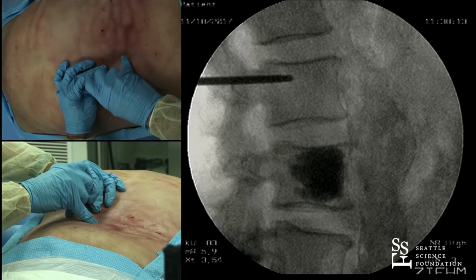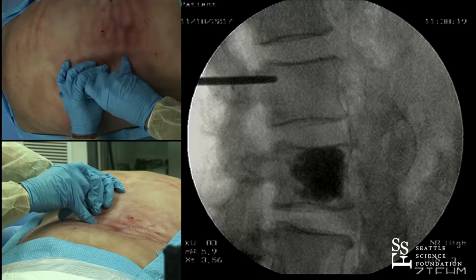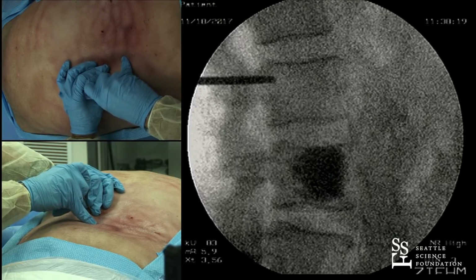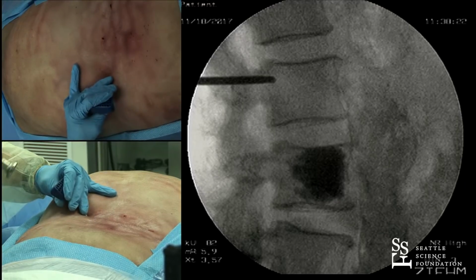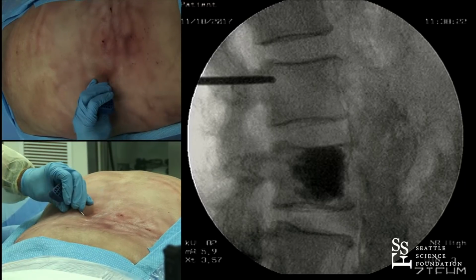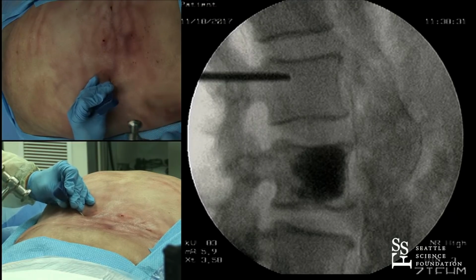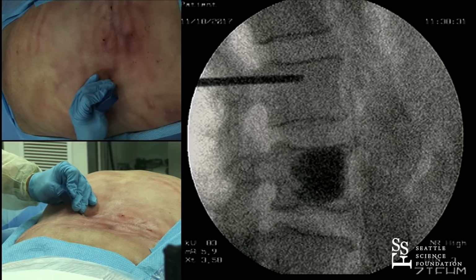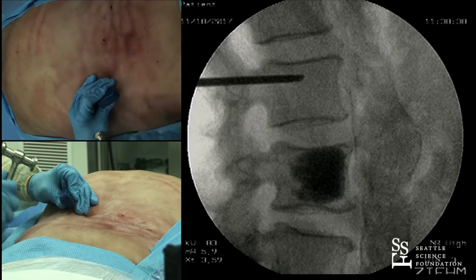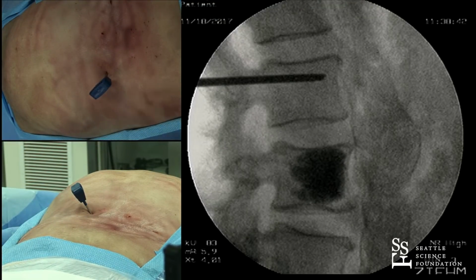He's backing up toward the base of the pedicle. He's now back to the posterior wall. Turn the bevel so that it skives you to the center. And I'm going to put this needle tip more medial. Angle it more medially, and you'll end up in the center of the vertebral body. What I'm going to do, instead of going out with the K-wire, I'm going out with the needle itself, because this is what gets more directional correction by far than just going directly with the wire. So I like that a lot.